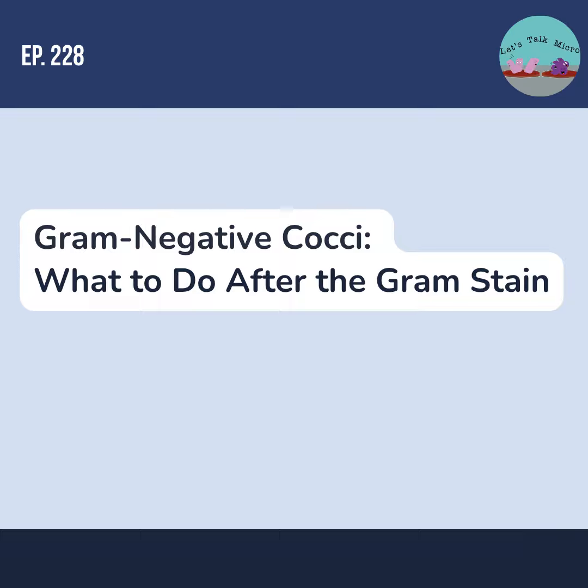There is also another medium, which you might see on your certification exam questions. It's called the NYC agar, or New York City medium. It has lysed horse blood, horse plasma, and the same antibiotics as modified Thayer-Martin. And according to Bailey and Scott's Diagnostic Microbiology, and we're getting technical, this medium has an advantage, which is that it grows organisms such as Ureaplasma urealyticum and Mycoplasma hominis.